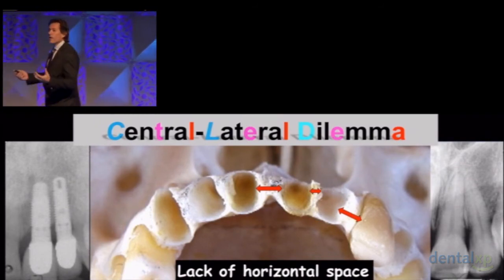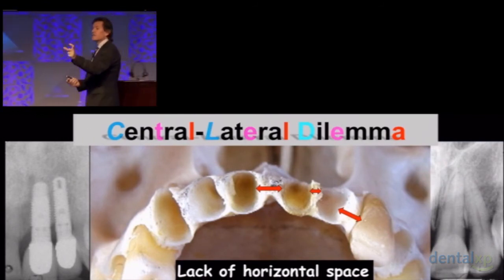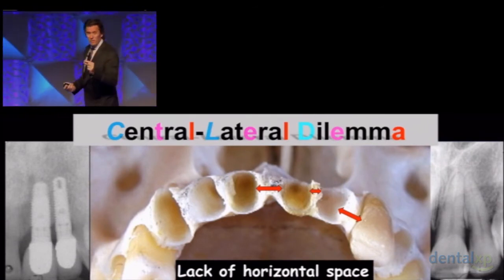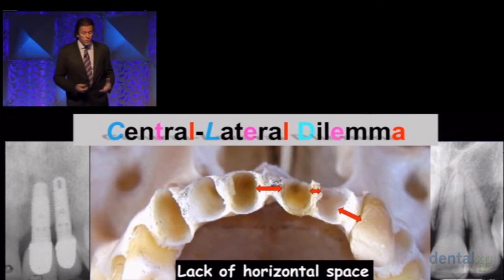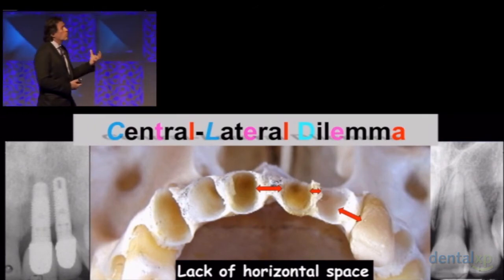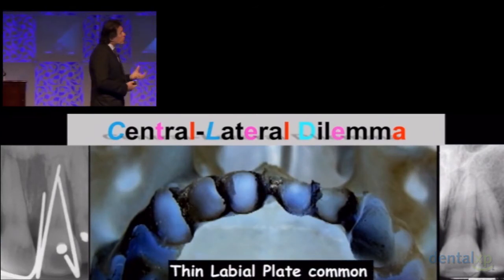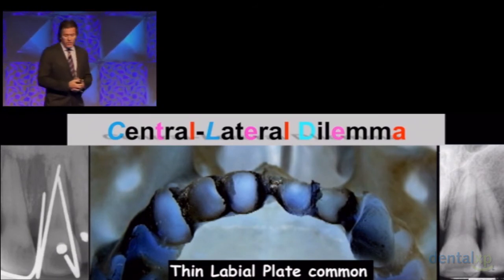So if Dennis Tarnow, who you've invited here and is incredible, and he's done his research, is telling you need at least 3 millimeter separation, but God said, I'm only going to give you 1 millimeter, you got to come up with another idea. You got to come up with another solution. You have to come up with strategies. Take a look at this on the light. This bone is mostly cortical bone. It's not very cancellous, doesn't have a large vascularity.